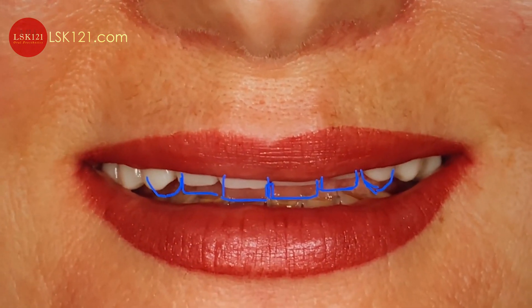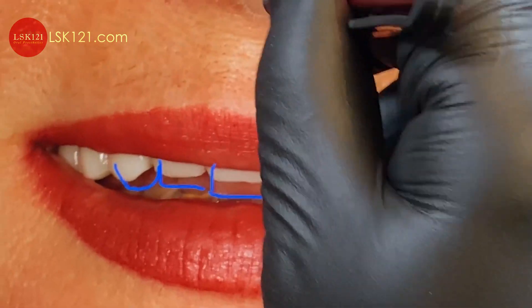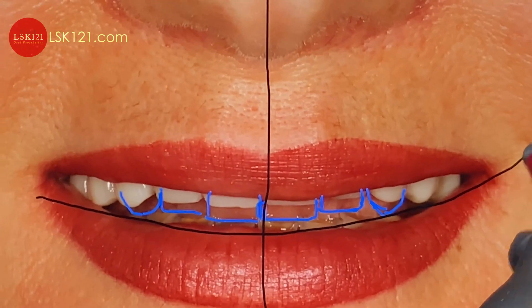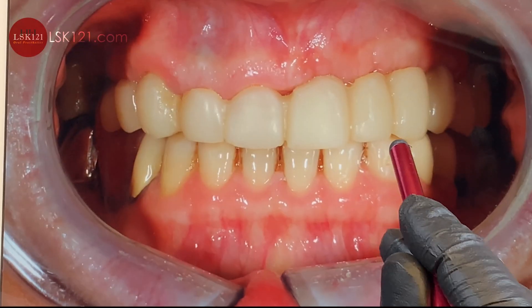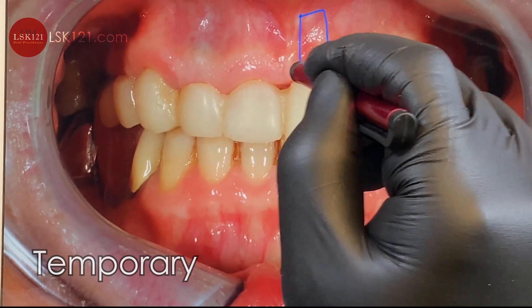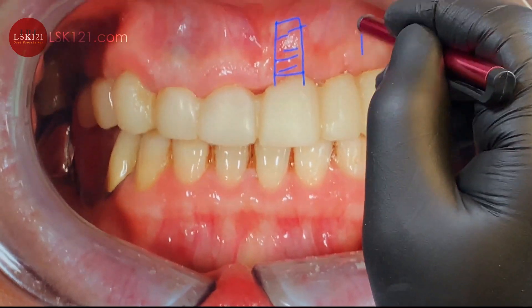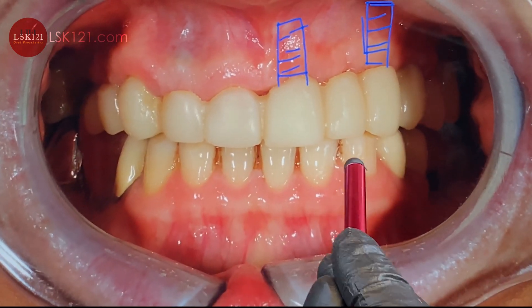Remember what I showed you before regarding the face bow — now you check all the way to midline and the smile line too, that's the main topic. This is the temporary the doctor fabricated before making the implant side. One side will be implant, and the other side will also be implant.